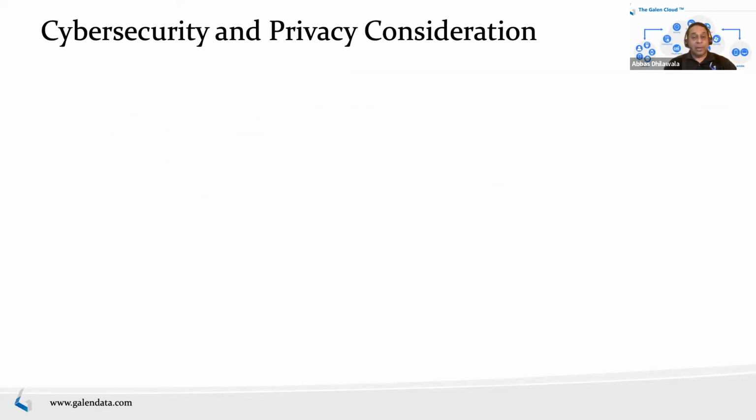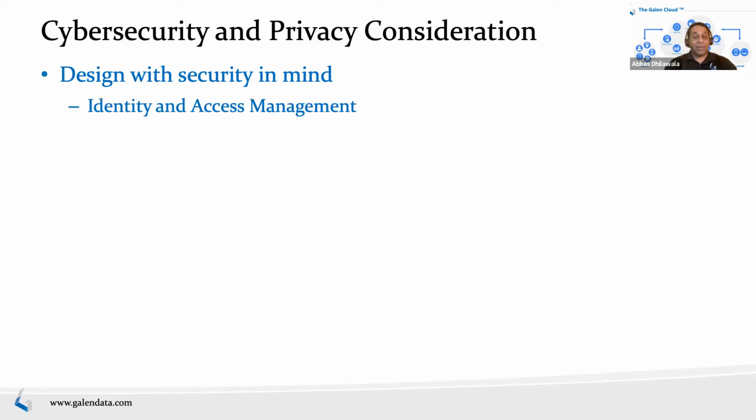And then once you have assessed the risk and as you move towards design of your device, again, keep security in mind. You want to understand security from the get-go, how everything is going to be accessed and operated. So identity and access management are very important, specifically if your device is going to not just send data but also retrieve or store data and have functions that can be accessed remotely. You want to understand who can do things, what the access rules are, and how you change them over time. And part of that is authentication.